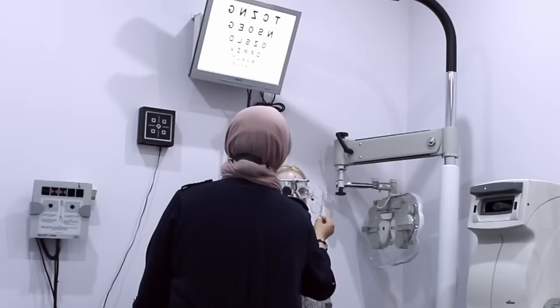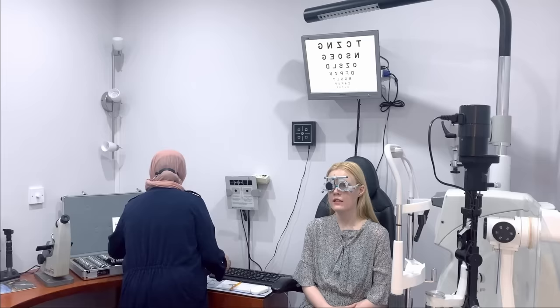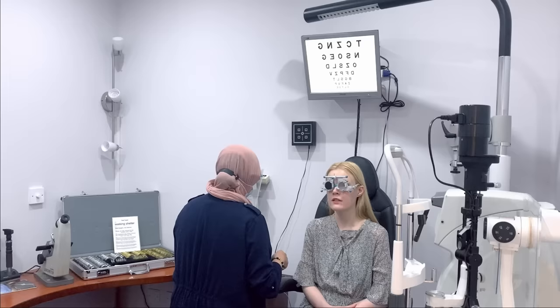Yes. Okay. Good. If you look at the top line again, look at the letter C again. Do you see much difference between that one and that one? This one's much sharper. So if I put that lens in, would you say it makes a difference to the lettering at the bottom of the chart? Oh, yeah, they're much sharper with it. Read it for me again. C, I think it's a C. Yeah. C-L-T-G-E. Much better, isn't it, this time?